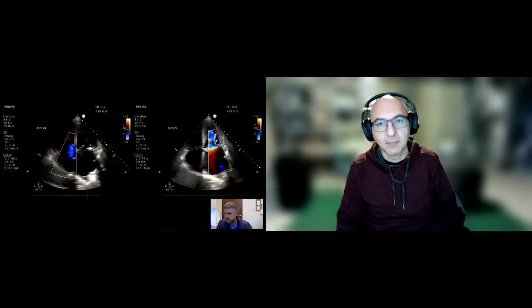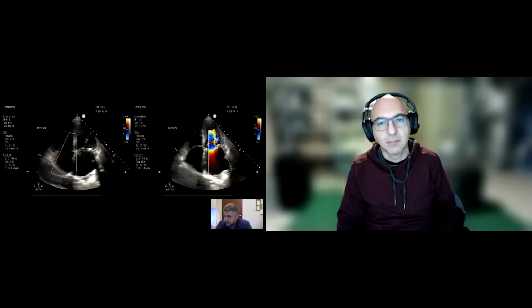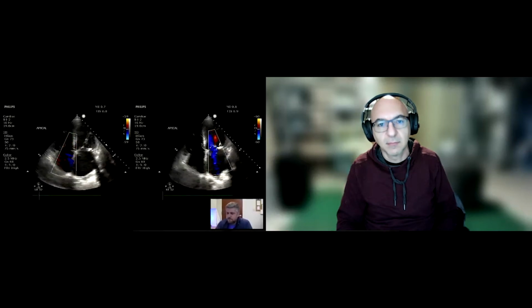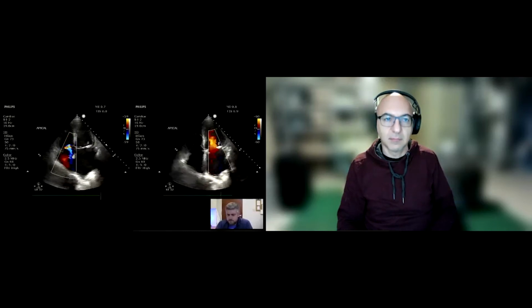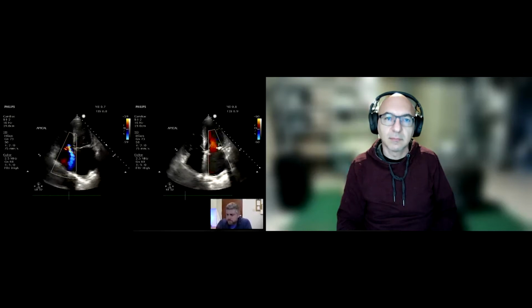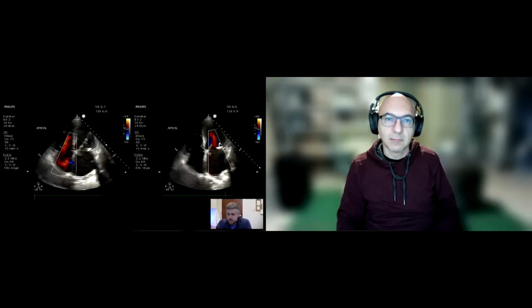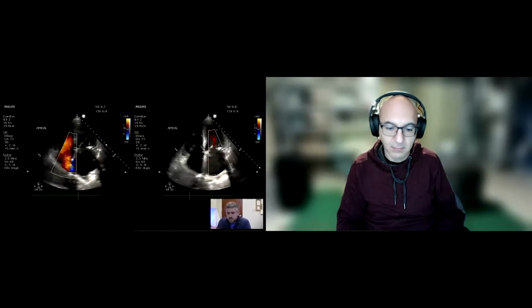Hey, it's Prerna. Matt, I jumped on a couple minutes late, but first of all, I'm really glad we're doing this topic. But I have a question for you. As far as the plethoric IVC goes, do you have a number that you use? Do you only use the greater than 2.1 that we see in data? Because there are so many papers with varying weight on whether a plethoric IVC and what numbers to use. Can you share a little bit about what variation percentage you would use and what absolute diameter you would use?